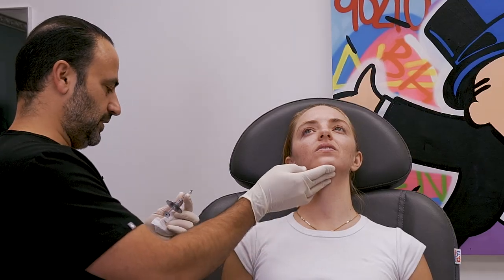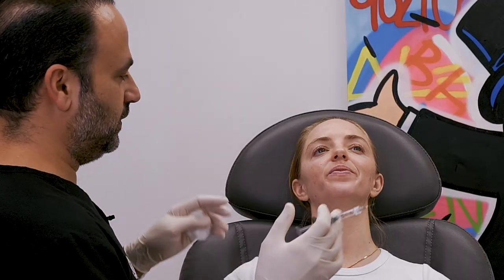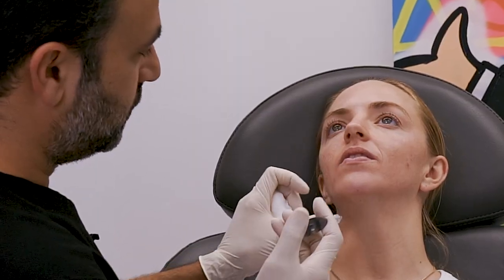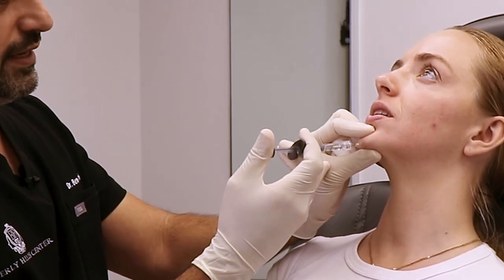With that tiny bit — about 0.2 to 0.3cc — she's already corrected. You don't need to put much; you just have to put it in the right place. People don't get that — they put a ton of filler. She has a tiny face and does not need a lot. Centrally, I like to go on the periosteum because we're building bony accent, not soft tissue accent. You don't want to keep adding filler to the chin anteriorly because it'll make your chin doughy.